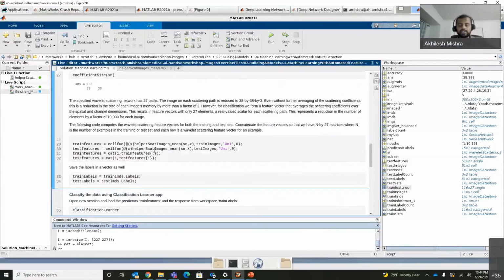And I would again emphasize that this process, wavelet scattering in 2 lines of code, can be 100% verified and validated. It is not a black box. The wavelet coefficients and the filter banks are known. And verifying and validating this feature extraction method is as simple as doing any other low pass or high pass filter for that matter.